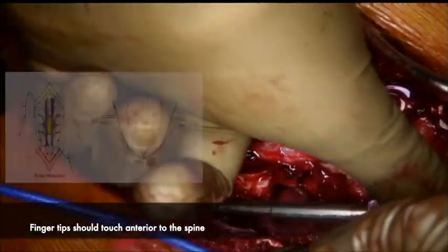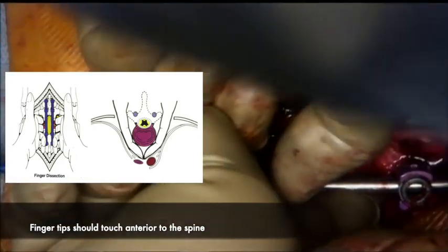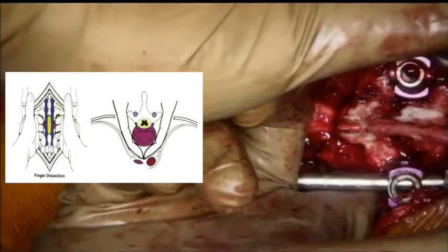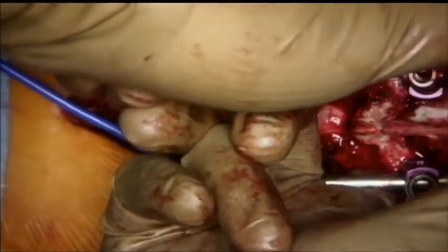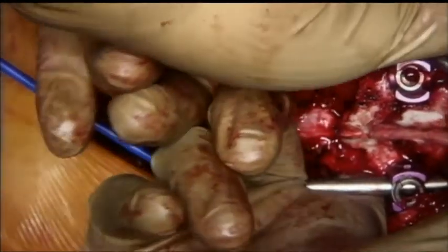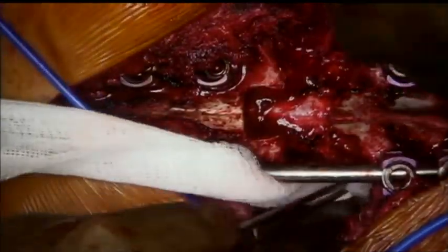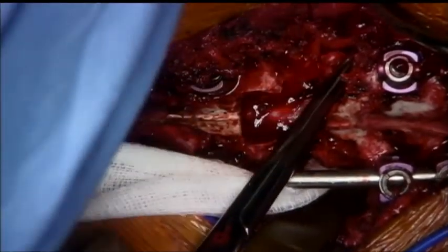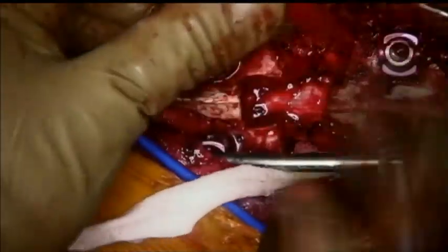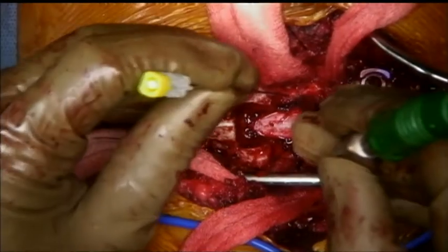Finger dissection is done bilaterally, with the aim of getting around the spine such that the fingertips touch each other. This gets the great vessels and viscera away from the spine. This is a key step in this procedure, as inability to successfully get around the tumor makes it very difficult to remove it en bloc. Using a right-angle instrument, a long ribbon gauze is placed between the spine and the important anterior structures, and several of these can be passed around the spine.